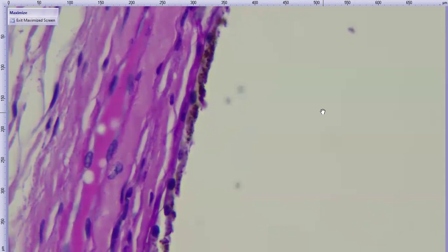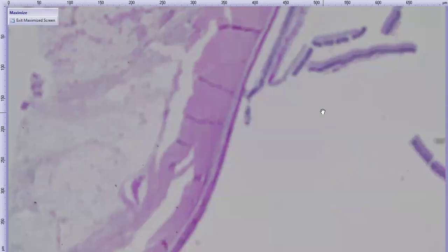The reason why I was particularly hunting for it, though, in this case, is pigmentary changes in the fundus of a horse have been associated with lipofuscinosis and basically vitamin E conditions, low vitamin E in horses. So there isn't really strong evidence to support that that's what's going on with this horse's fundus, but I suggested that they check the horse's vitamin E status in any case, and maybe diet.